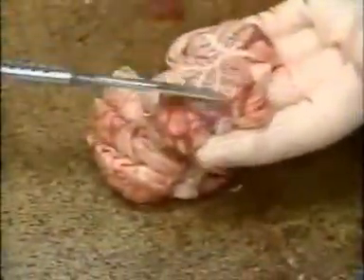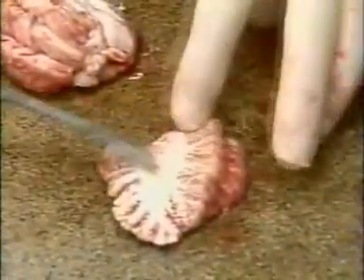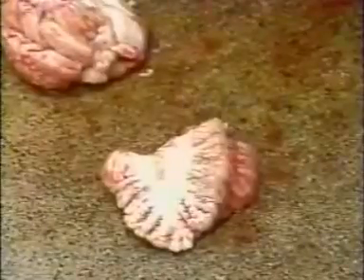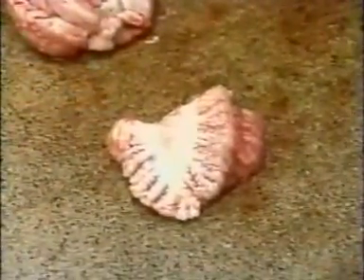I think this is the cerebellum. This central lobe right here is the vermis, the part that goes bad in malnourished alcoholics. This is the dentate nucleus, which is one of the places we look for signs of interruption of oxygen supply. It's very sensitive. The coordination center of the cerebellum.